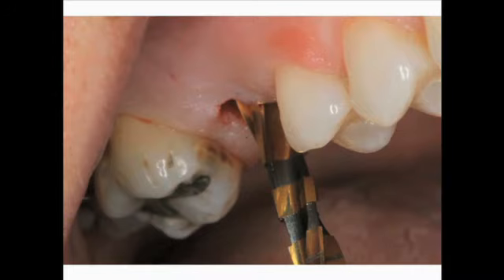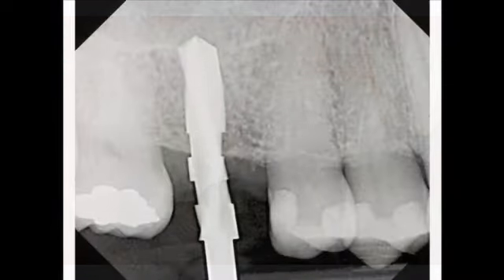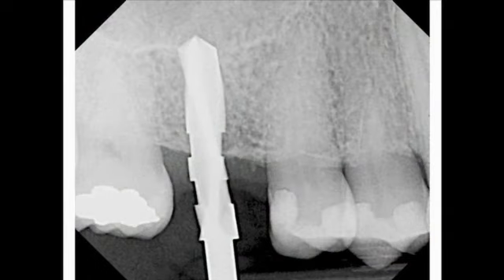We are drilling at about 1200 RPMs during these procedures. And the same procedure is done. We go to the proper depth. A radiograph is taken with the 4.1 millimeter twist drill in ideal position at 9 millimeters of depth.